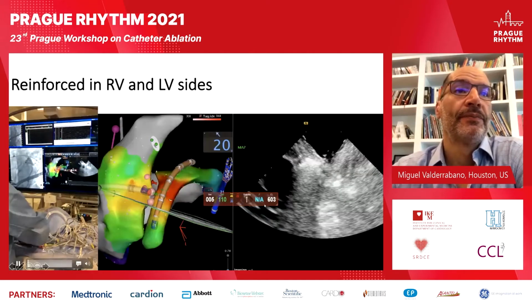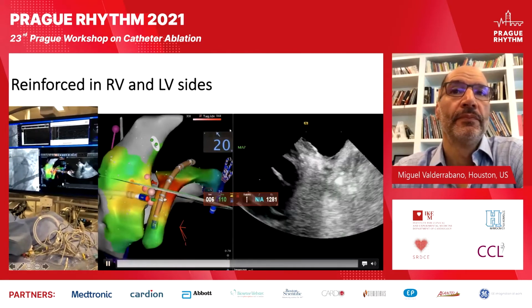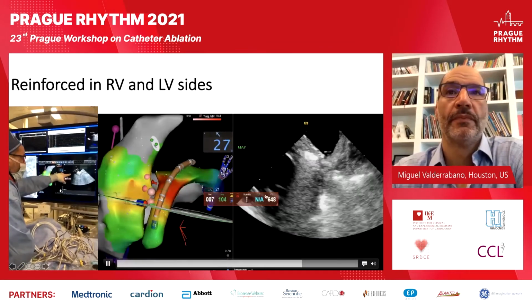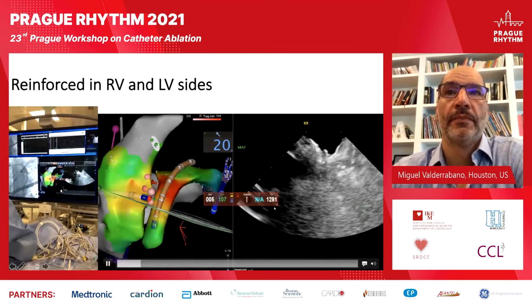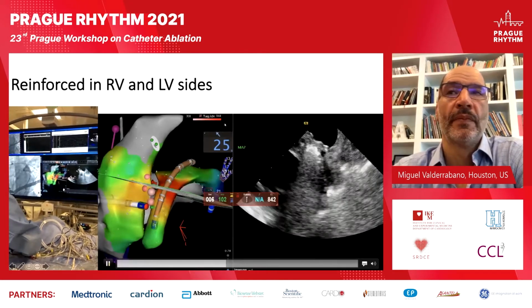So we are now touching up the ablation to complete the job from the right side. You see the echogenic area deep in the muscle there. We treated with alcohol, and then I'm ablating adjacent to it from the RV to complete the job.